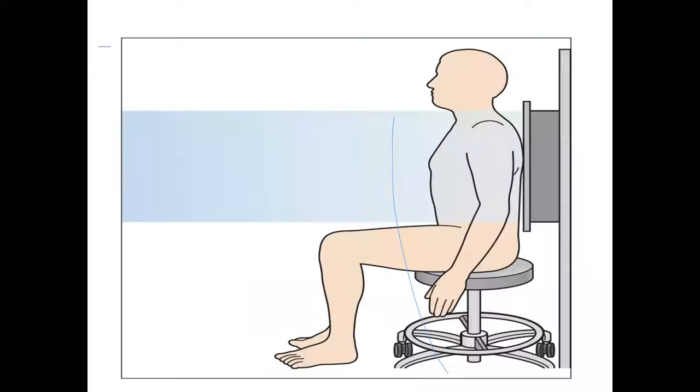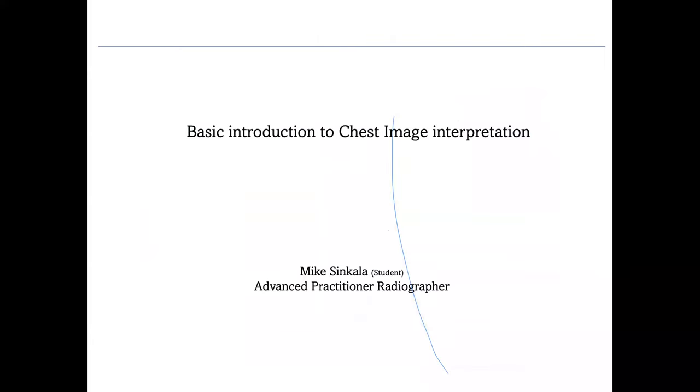The last images you have explained, I think that arose from myself and Mr. Cuthbert Murenga about pulmonary edema. You have explained cephalization can be seen, and you have explained everything there. Because when you see cephalization on a chest X-ray, it's related to a cardiac problem or pulmonary edema. Thank you so much about that.